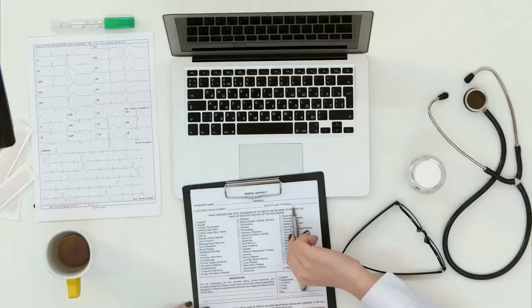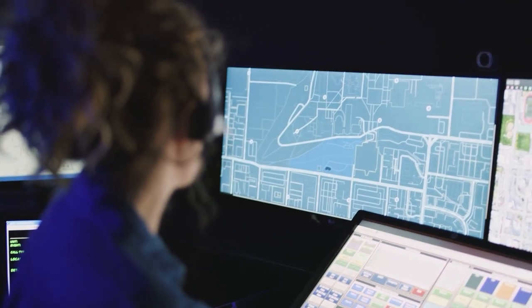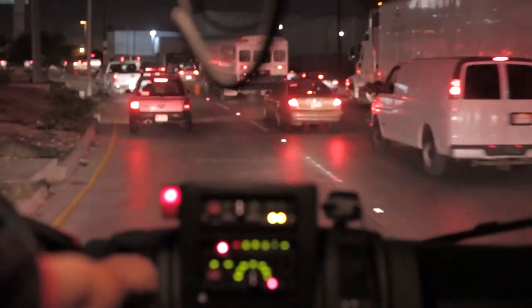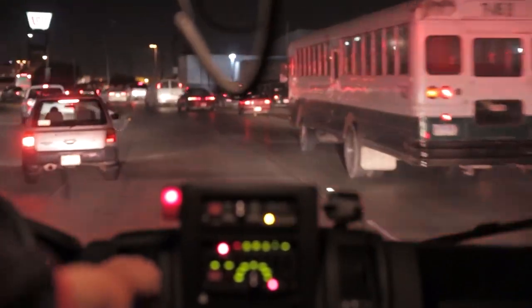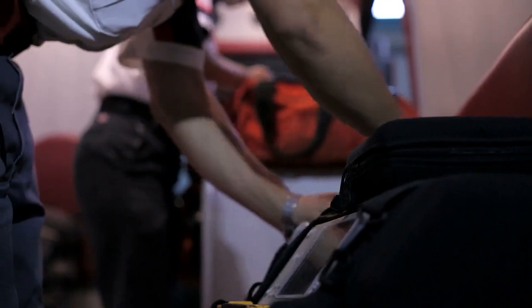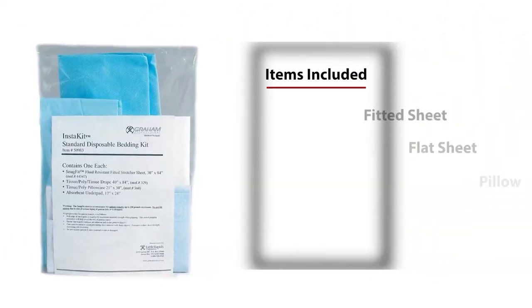Level zero? Backed up on paperwork? Dispatch blowing up your radio and pager? Sounds like it's busy to me, and we've all been there. The last thing you need to worry about during days like this is getting your cot quickly ready for the next call. And I'm happy to let you know that the Instakit has got you covered.